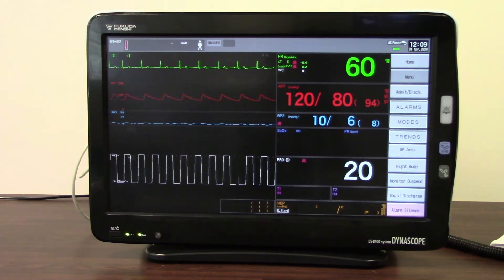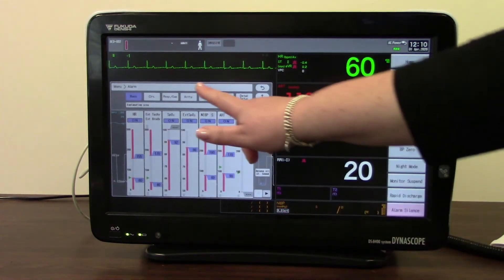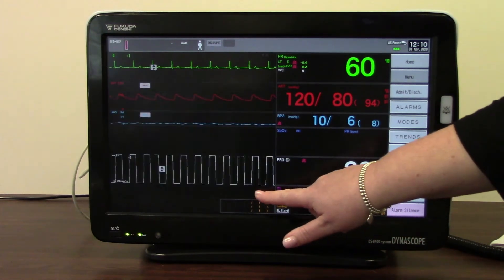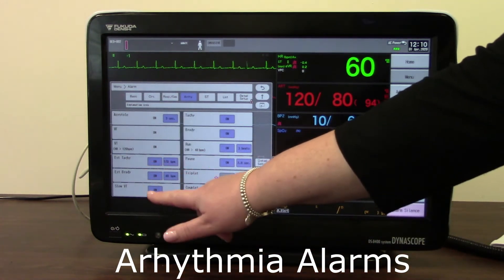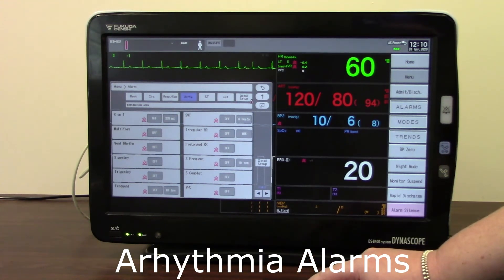Moving on to our arrhythmia alarms — as you saw when I went into the alarms menu and into my basic setup, I can also access my arrhythmia alarms from there. This allows me to check how my arrhythmia alarms have been set up, and I can page along to see what's on and what's off. Asystole, VF and VT alarms are generally fixed to on for most departments. If it's a neonatal unit, you will have the choice to turn those on or off. I can alter the amount of seconds before my asystole alarm will alarm, and I can turn any on or off as appropriate, and page along to check and set any.